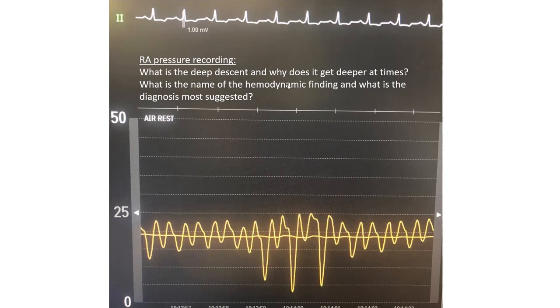What is the name of the hemodynamic finding? The mean RA pressure doesn't change much with respiration. So this is what we call the Kussmaul sign. We have Kussmaul sign and deep Y descent, especially in inspiration. What is the diagnosis most suggested? Overwhelmingly, it is right heart failure.